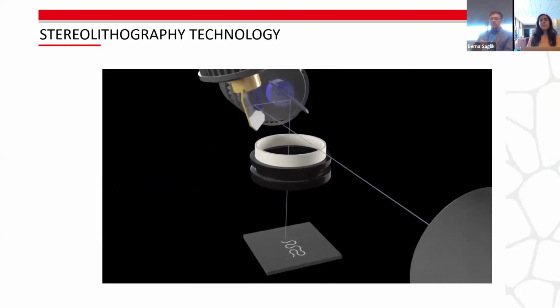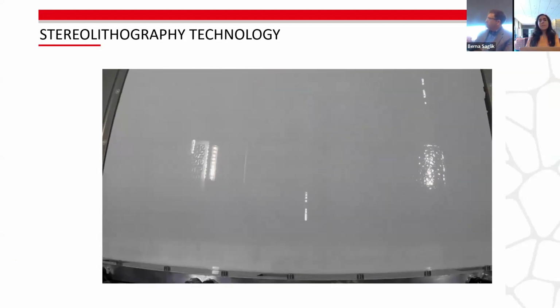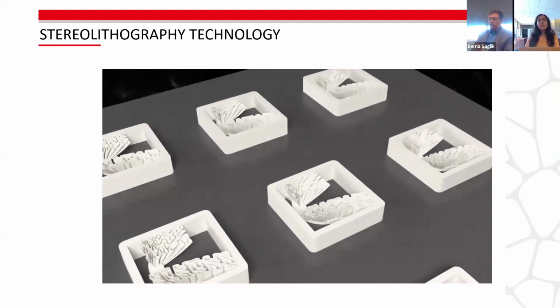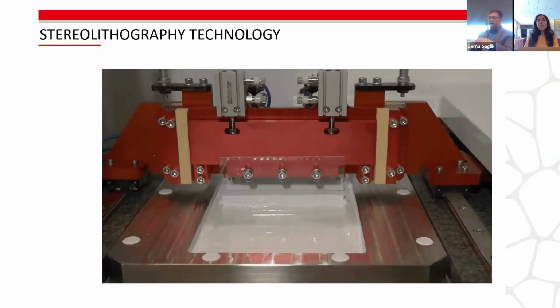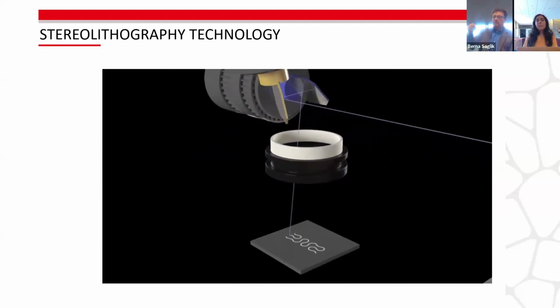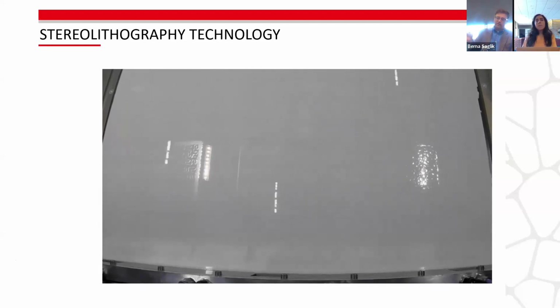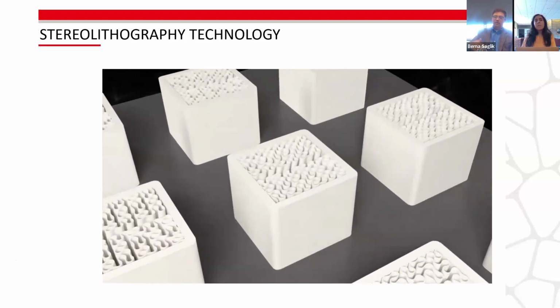So a little bit about the process. So laser SLA printing, you're basically using a laser as shown here to create a layer. That layer is cured in a photopolymer, and then layer after layer, it gets built up. So we recoat, we cure a shape with the laser, and then we recoat again. What we're showing here is actual parts being made, one layer after another, building up.